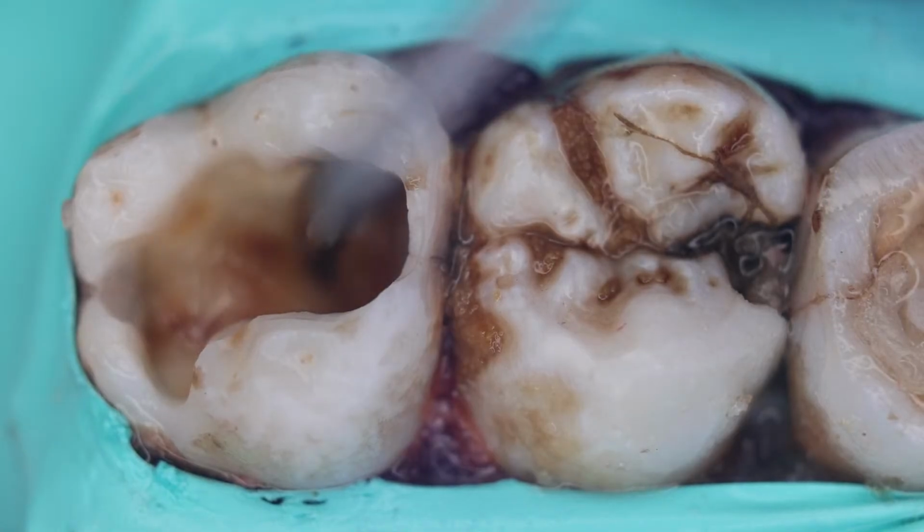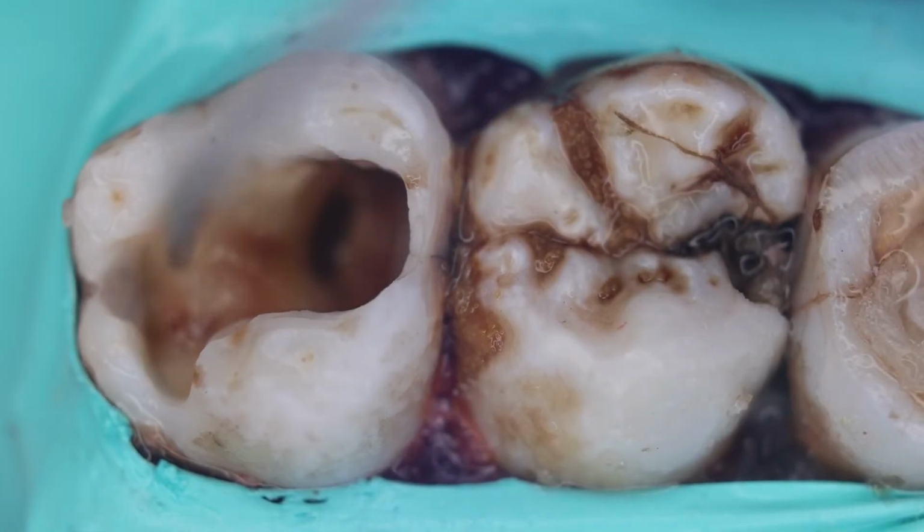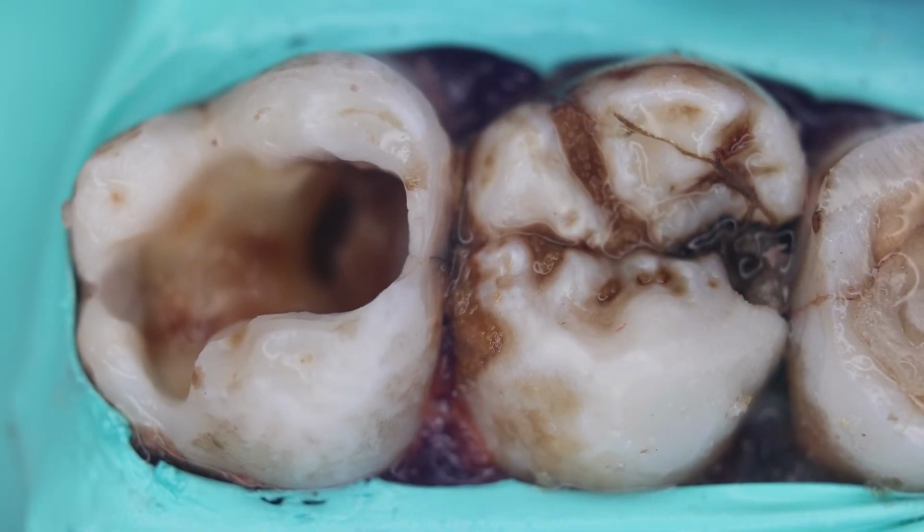So now our planning, since it is more than 1 millimeter exposure, is that we shall plan for the pulpotomy treatment of this particular molar. Hope the things were clear to you.